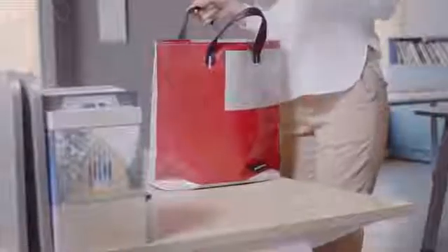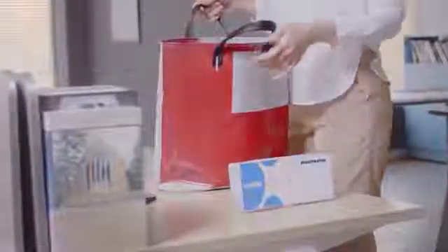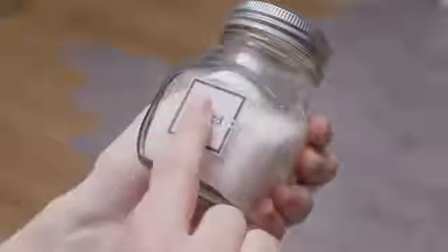The Brailler is portable and easy to carry. It also lets you quickly duplicate labels. Communicate with everyone.